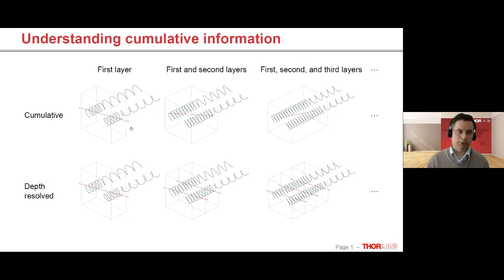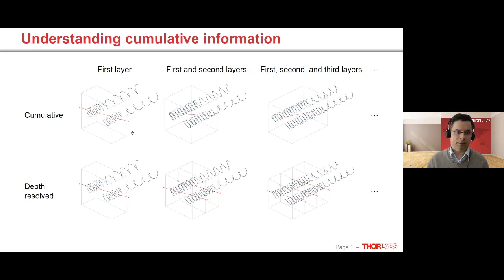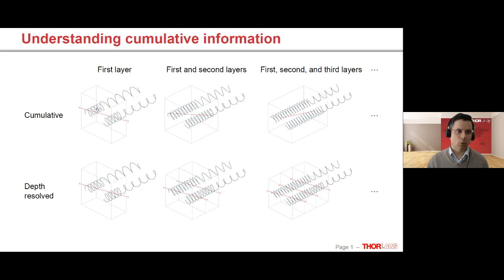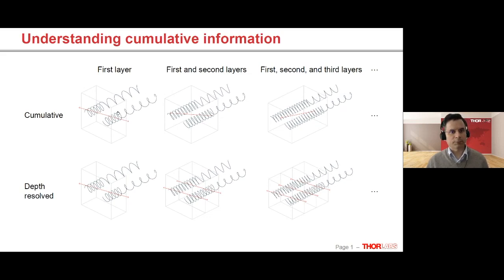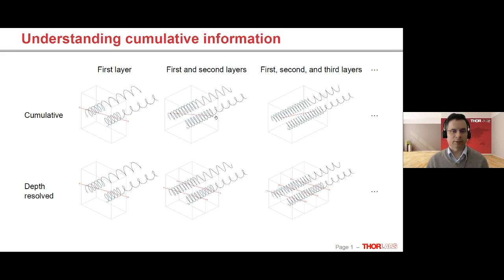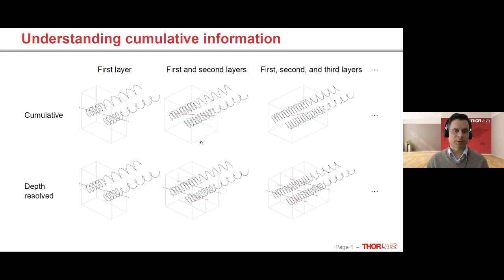Let me consider the following pictures above. In the top row, I have a sample that always has the same optical axis, or a uniform retardation. When I explore only one layer, I get incident light and outgoing light, and then I can compute what the characteristics are. If I have more layers, but I cannot distinguish them, then the incident light is exactly the same, but the outgoing light is different, so the properties of the material are different.